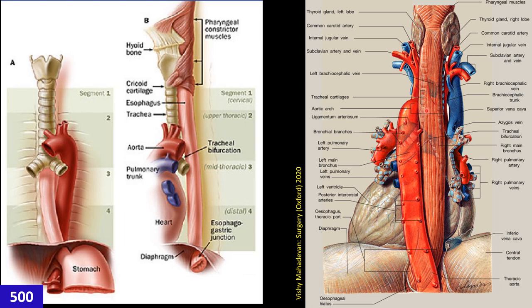The esophagus passes through the posterior of the heart, and at some specific spots it is almost in contact, especially at the left atrium. The esophagus is in direct contact with the left atrium, without any other structure between. At a little upper part, the esophagus is posterior to the trachea, especially at the bifurcation, which is one of our levels for imaging the aortic arch.